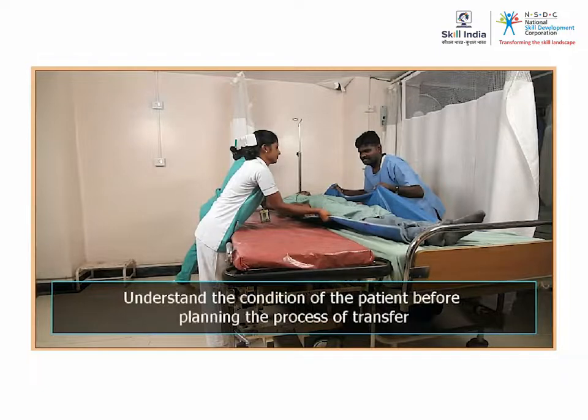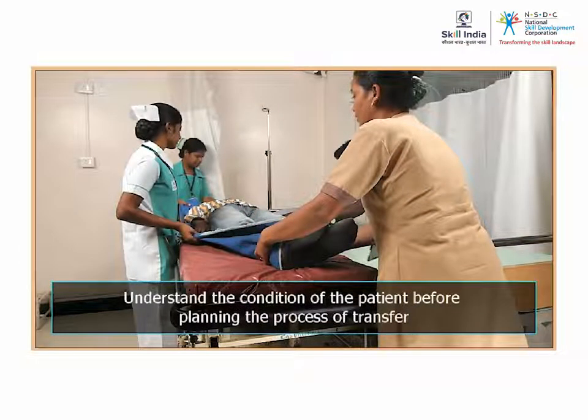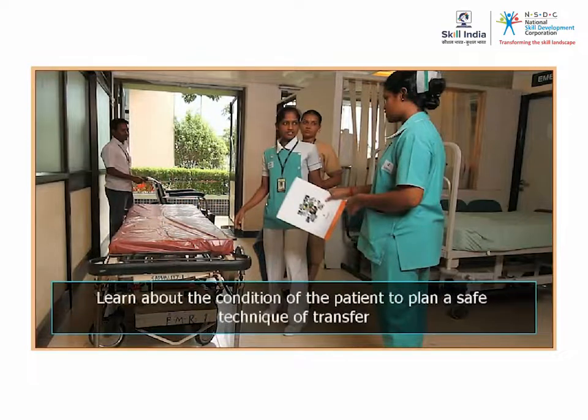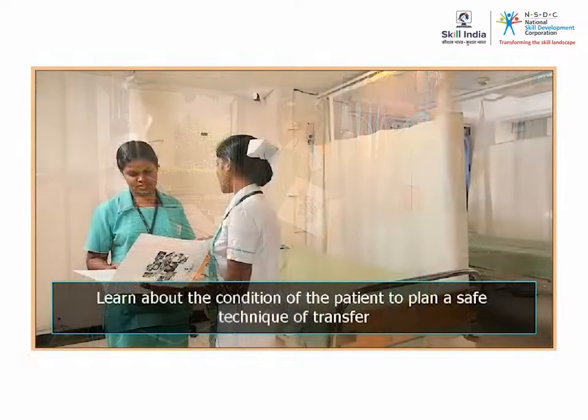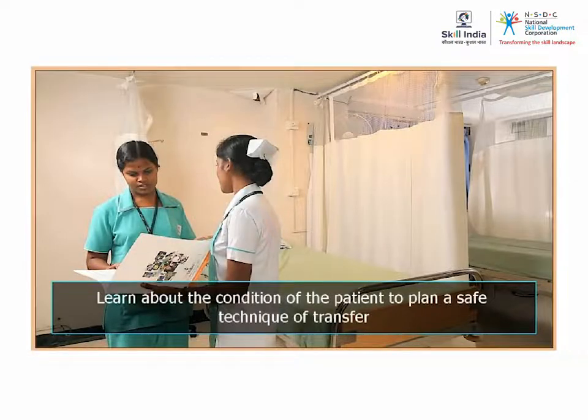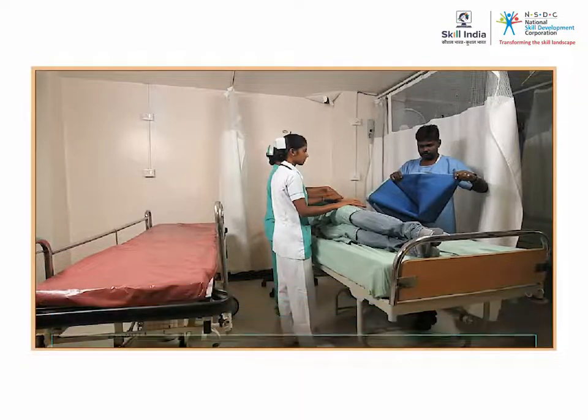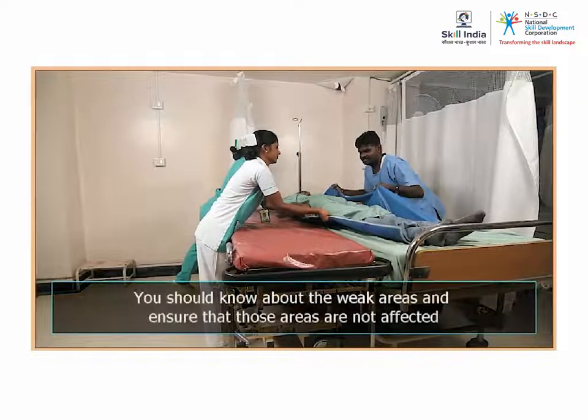When you use a stretcher, you must understand the condition of the patient before planning the process of transfer. Ask the nurse of the patient about the need for transfer of the patient. Learn about the condition of the patient to plan a safe technique of transfer. In many cases, some parts of the patient's body are damaged or very weak. You should know about those areas and ensure that those areas are not affected when the transfer is carried out.